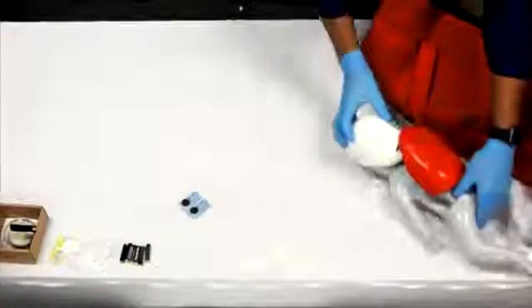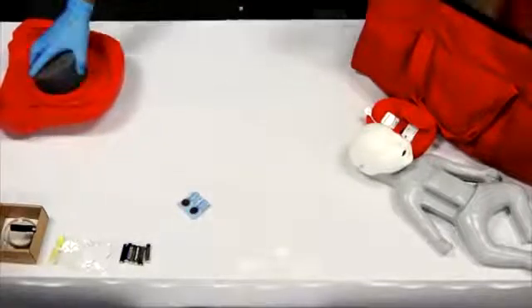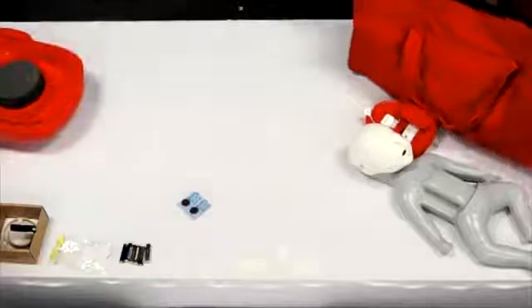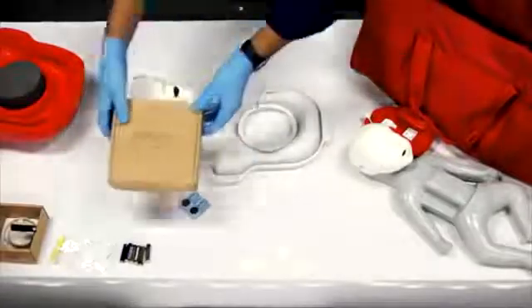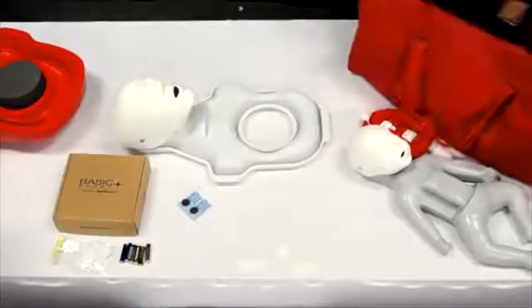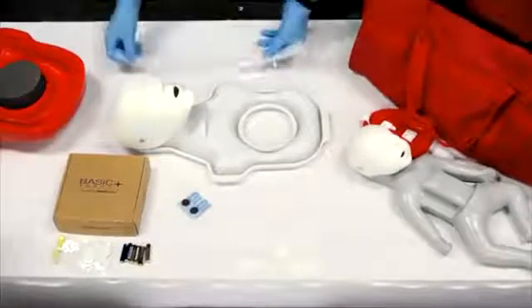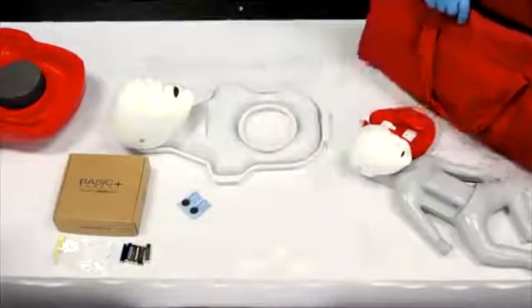So now let us review our Basic Buddy Plus and Baby Buddy Plus. First, let's keep in mind that the applications for instructor and student are exactly the same as previously shown. So we'll just take a few minutes to review the differences with setup on Basic Buddy Plus line. Similar to CPR Prompt Plus, Basic Buddy Plus and Baby Buddy Plus also come with a supply of face shield lung bags, 10 for each mannequin in the associated configurations.